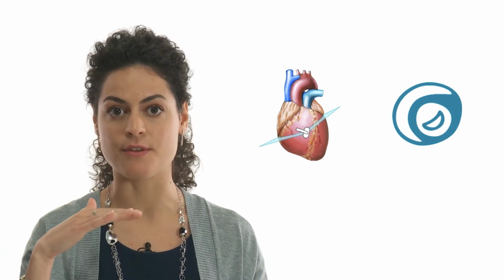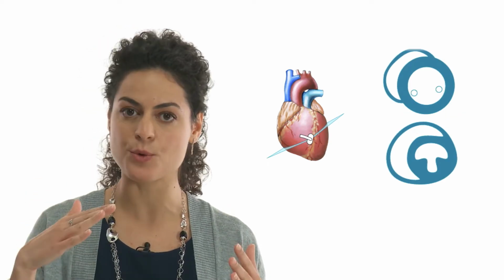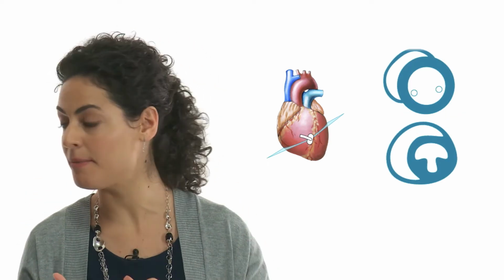And this is what Thomas just said, the standard views which you should record when you want to perform a standard exam. So, the parasternal short axis at the base of the heart, at the level of the mitral valve, at the level of the ventricle, so somewhere in between the mitral valve and the papillary muscles. But remember, when you do the sweep, don't forget that you have intermediate views as well. And just as I mentioned before, look at them as well, because they could display some form of pathology as well. Yeah, that's completely true.